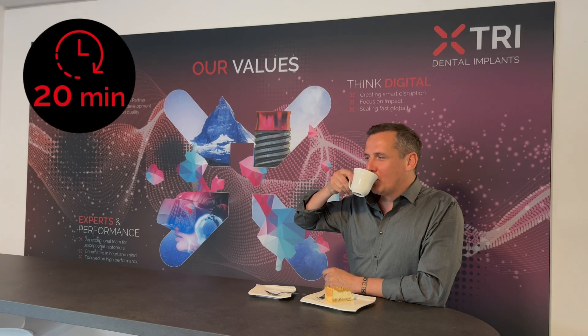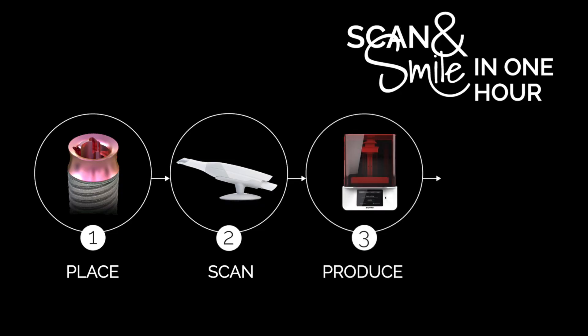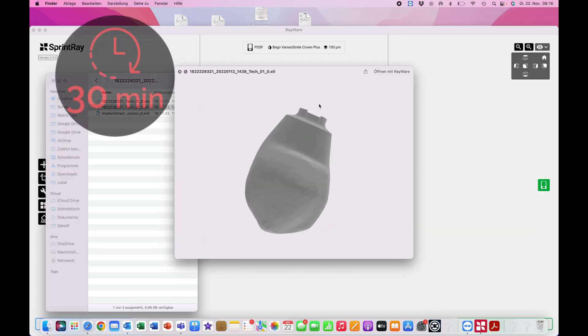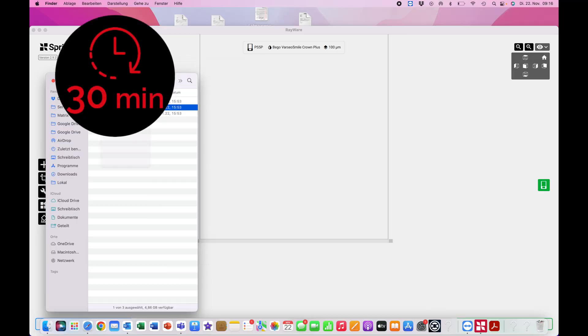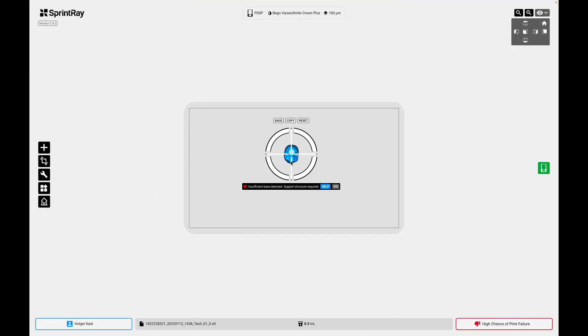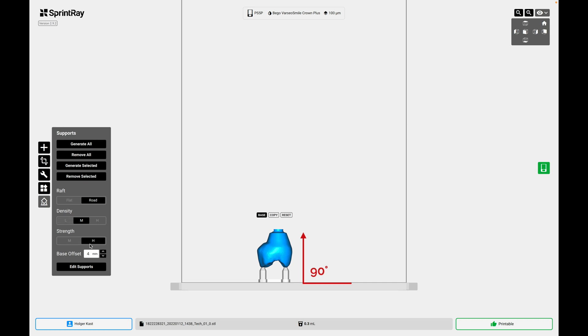Now it's time to enjoy a short break and wait for the design files. Next is the production of the 3D printed temporary restoration. After receiving an email with the files from the designer, review the prosthetic design and include the STL files into your 3D printing software. Nest the crown upside down. Make sure that the screw channel and the matrix connection are exactly 90 degrees angulated to the printer platform. Select thin supports and position them on the occlusion side. Make sure that no supports are touching the screw channel or matrix connection.